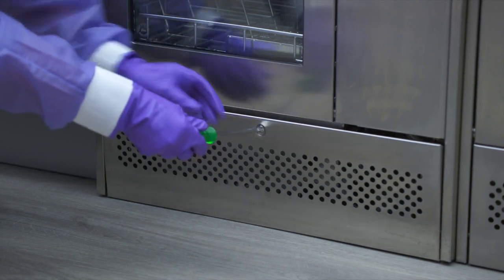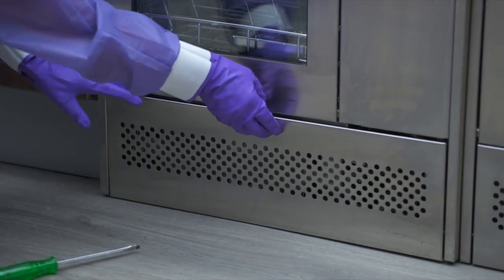In case of a power outage, there is a manual release mechanism located in the kick plate.